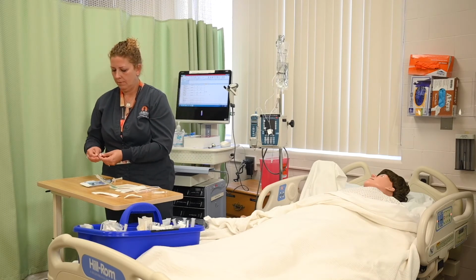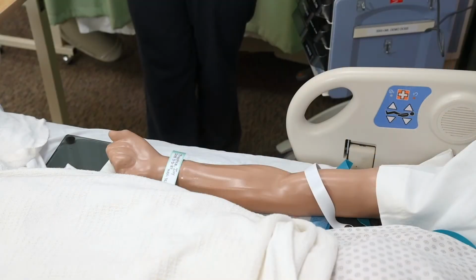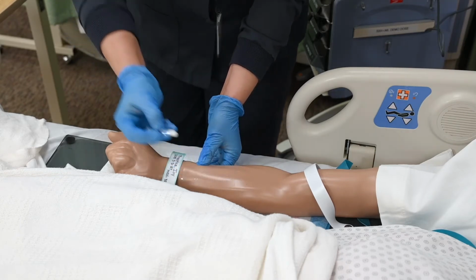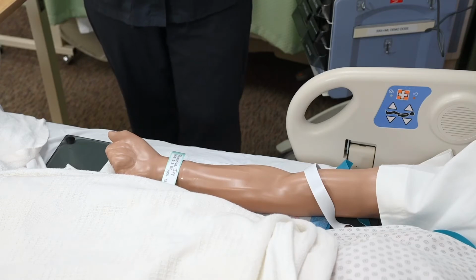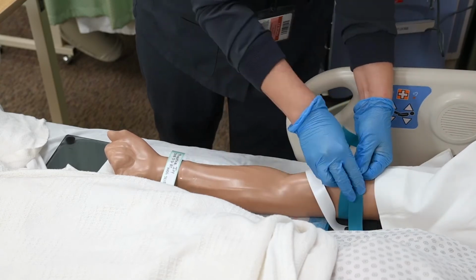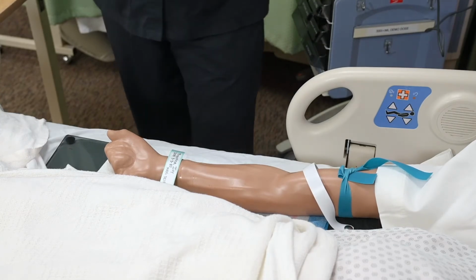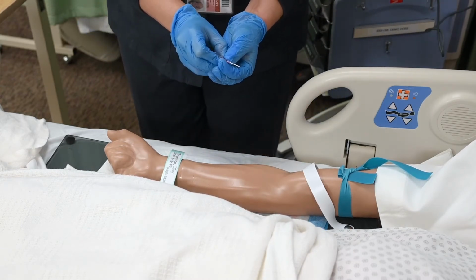She will now perform hand hygiene and apply clean gloves. And then prepare the site with alcohol or other cleaning agent per facility protocol. Do not touch insertion site after cleaning. Reapply the tourniquet 4 to 6 inches above the intended insertion site. Allow the site to dry. Stabilize insertion site by applying traction distal to the site.